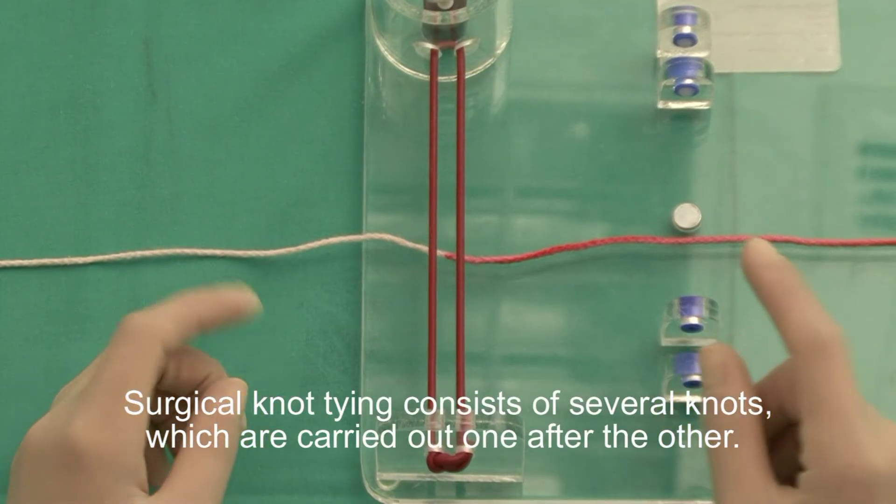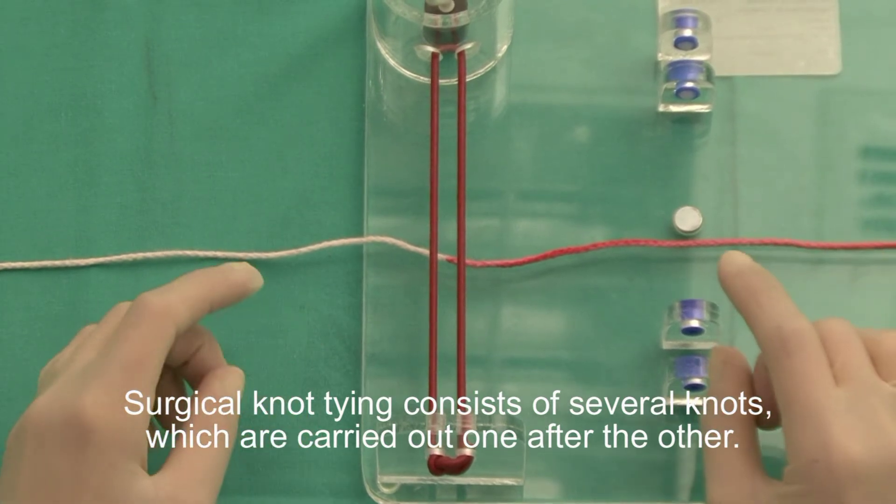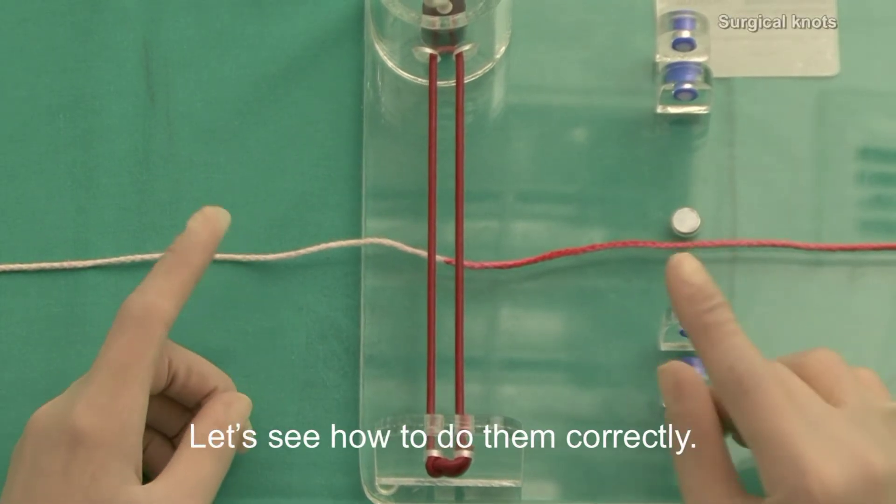Surgical knot tie-in consists of several knots, which are carried out one after the other. Let's see how to do them correctly.